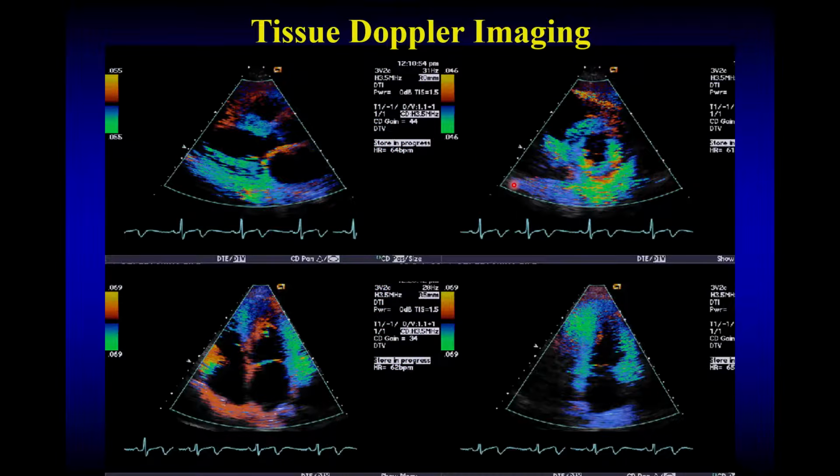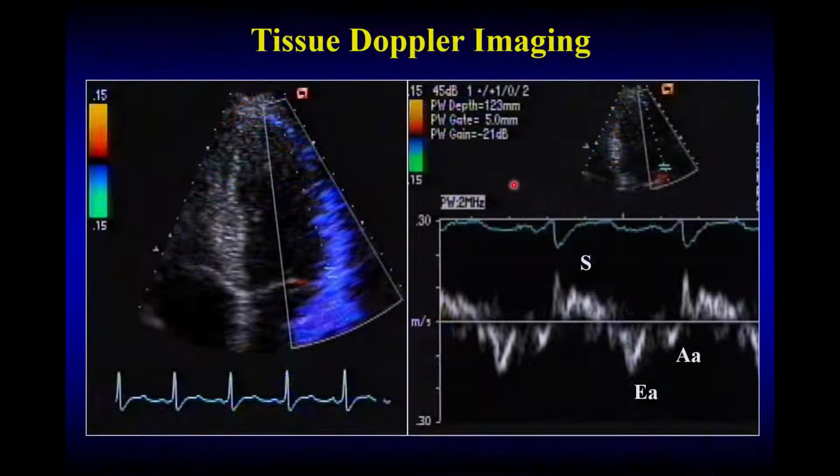I wouldn't say new anymore, because it's been in existence for close to 20 years now. And in the past, we preferred not to take a look at Doppler of the myocardium per se, but nowadays the intrinsic properties of the myocardium, and their importance, have certainly shined very nicely as to looking at the properties in systole as well as in diastole.